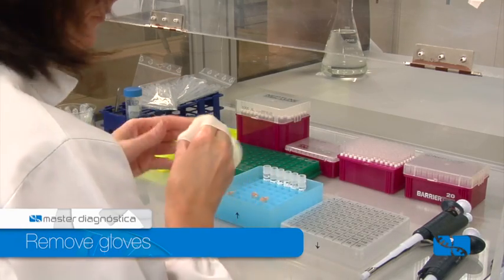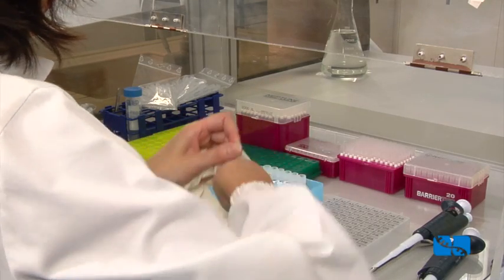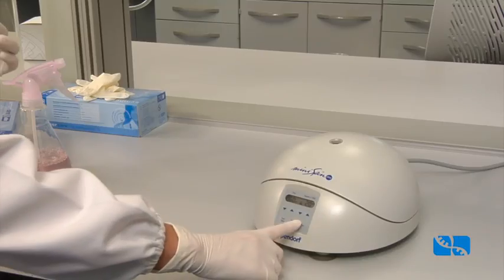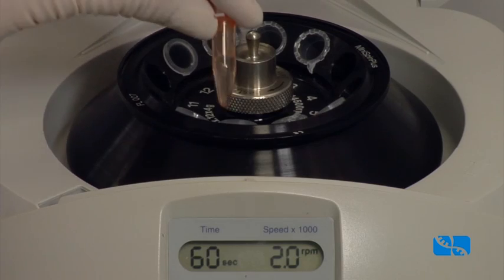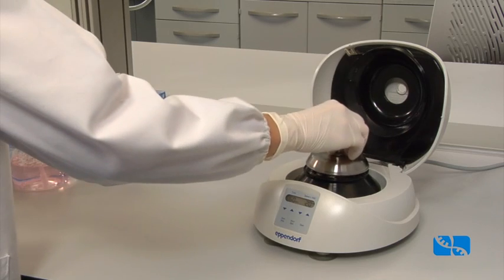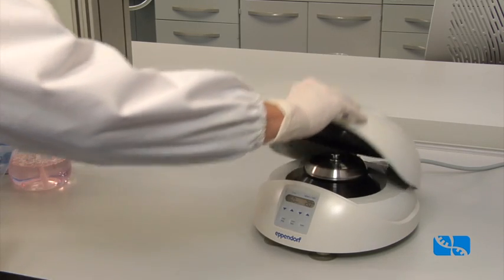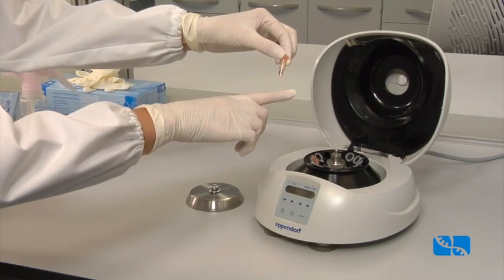Remove gloves and throw them away in order to avoid contamination between samples. Take the following sample and proceed in the same way, as many times as liquid-based cytology samples are going to be processed. Centrifuge Eppendorf tubes at 2000 rpm for 1 to 2 minutes. Take them out of the centrifuge and check if the pellet is in the bottom.